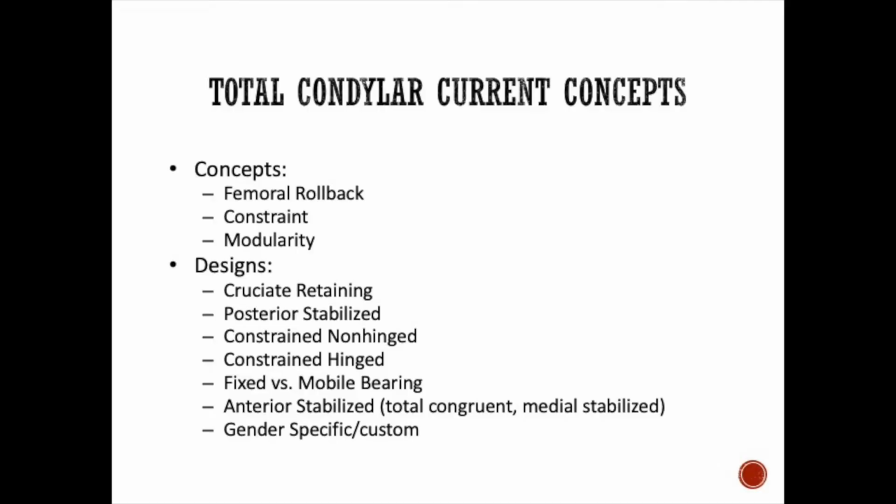Designs that exist include cruciate-retaining, posterior-stabilized, constrained non-hinged, constrained hinge, fixed versus mobile bearings, anterior-stabilized, which includes total congruent and medial stabilized components, and gender-specific or custom components.